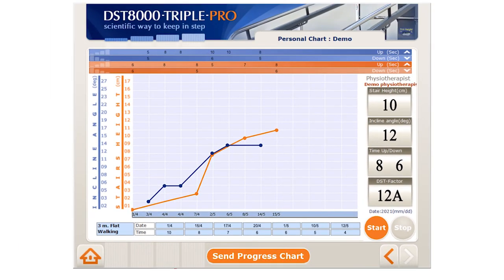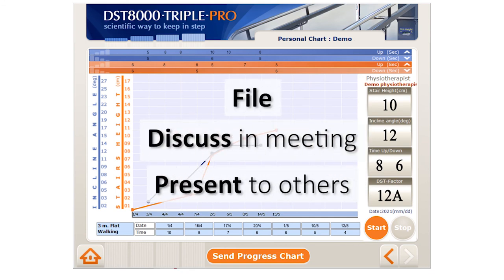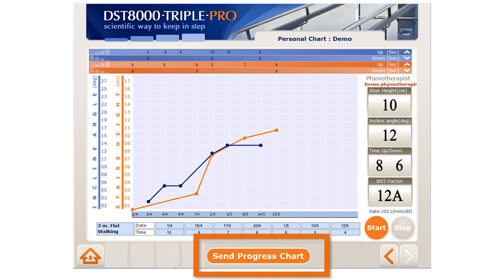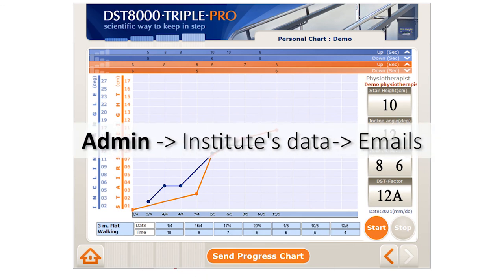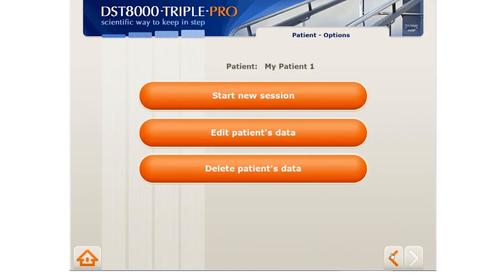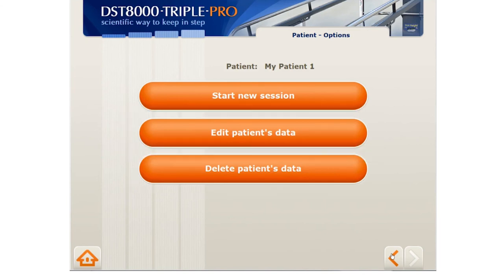If you want to send the patient's progress chart — either to file, discuss in a meeting, or present to a third person — press here. The chart will be sent to the emails previously defined by the administrator. If you go back from the personal progress chart, you can either edit the patient's info or delete the patient. At any time, you can click the home button to log out of the system.